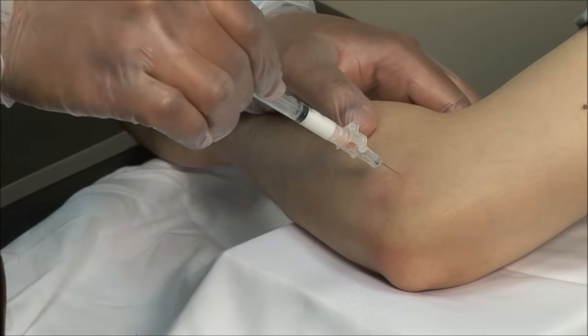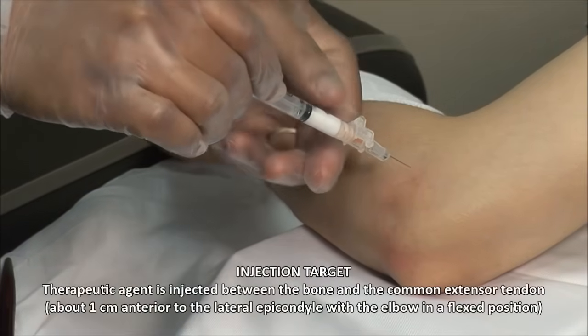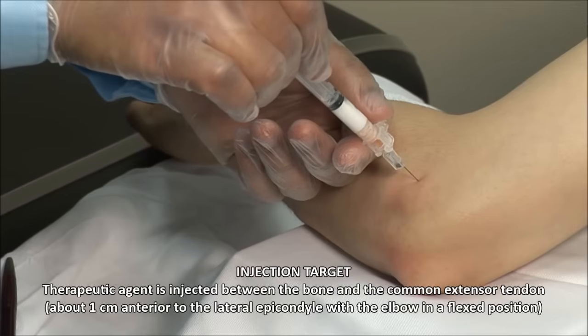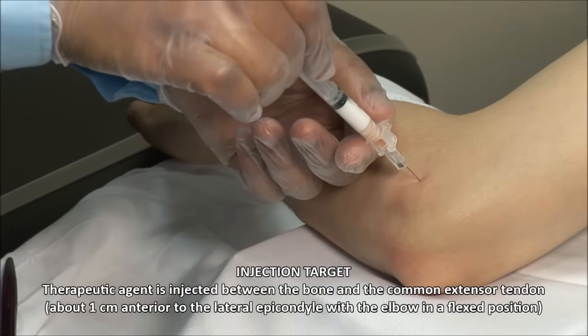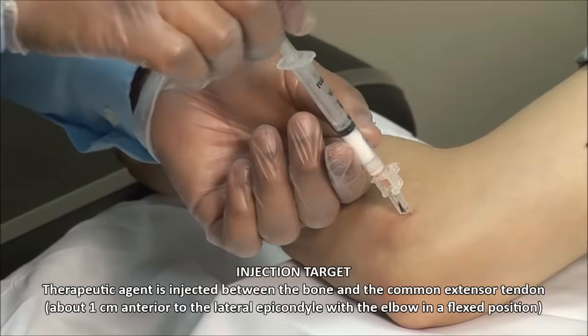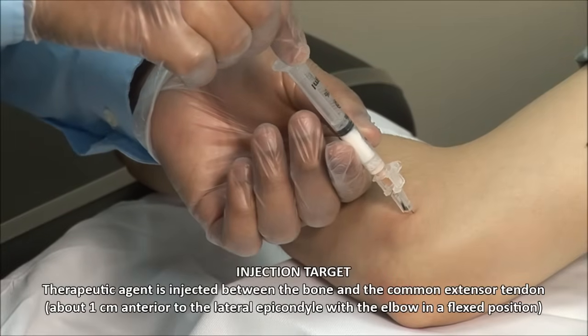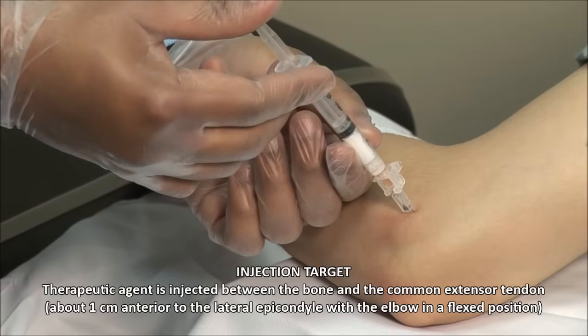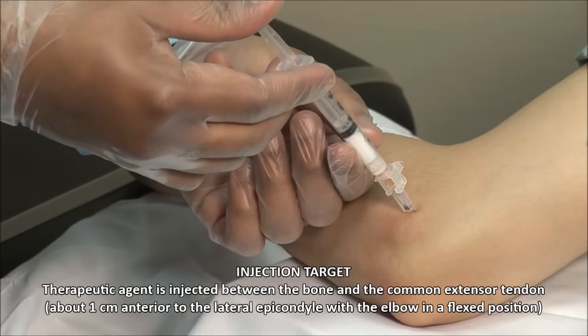Using your mark, advance the needle down to bone, and then withdraw just a little. Always aspirate to ensure you are not in a blood vessel. Then inject the solution. This should go in fairly freely.